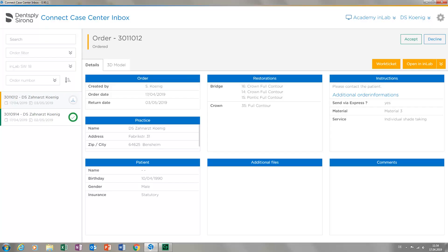We are already on the start page of our Connect Case Center Inbox. You can find detailed information about the installation and initial configuration in our video tutorial on the topic of Connect Case Center Inbox Initial Configuration. The start page is divided into several sections.